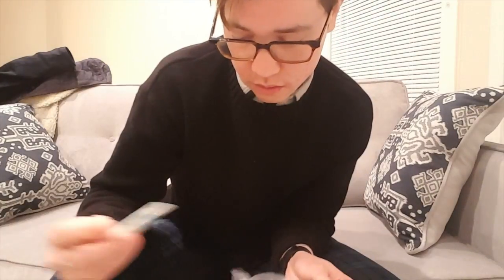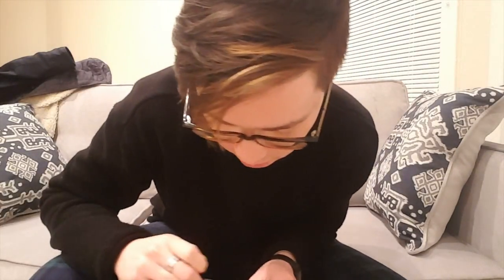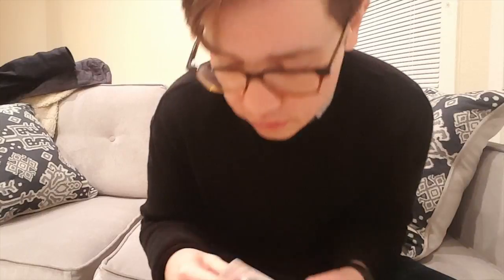When I get the needles out, this is an 18 gauge 1.5 inch needle. It's really big and scary, but I don't have to use that on myself. A 23 gauge 1 inch needle is what I use to inject. The 23 gauge needle I found is better than a 22 gauge in the sense that I bleed a lot less. It seems to be fine to transmit the drug, and it's easier coming out, doesn't hurt, doesn't sting, and I don't bleed. So, 1 milliliter syringe.